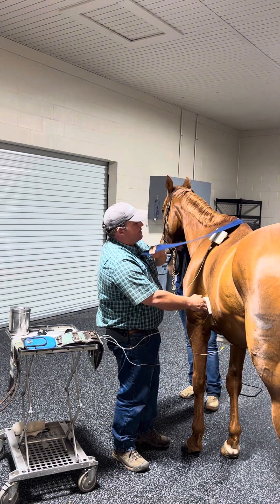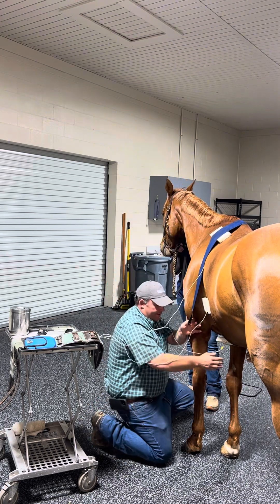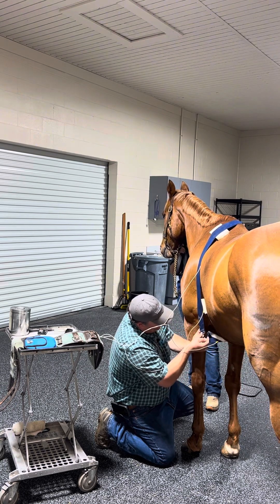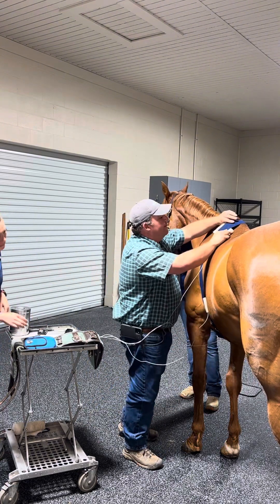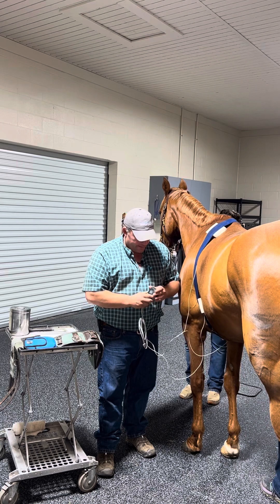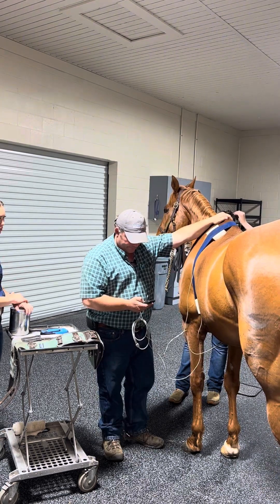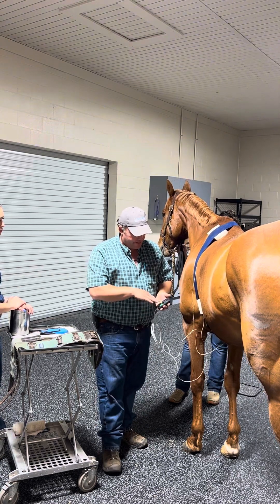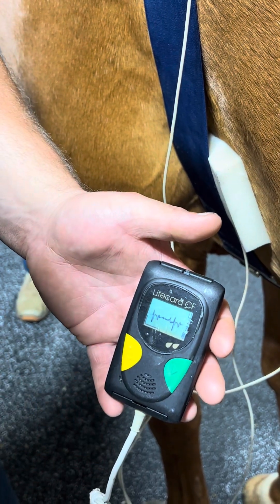So we'll lay this blue elastic strap over. Let's tighten that up just a little bit. Once that's in place, we will attach our ECG. You can see our ECG is transmitting on the screen.